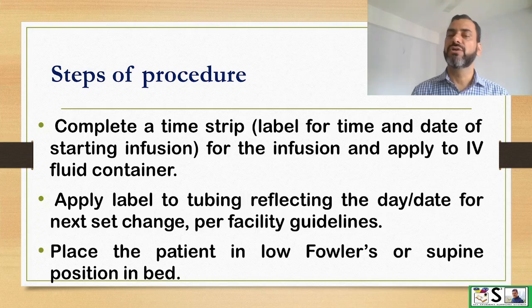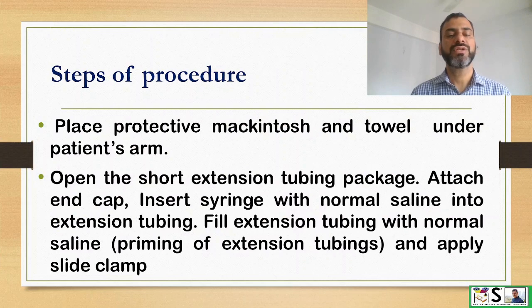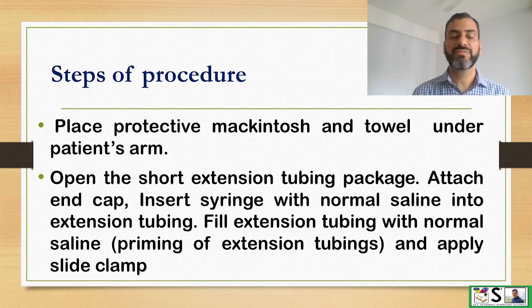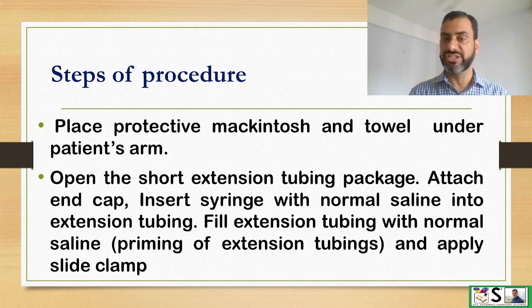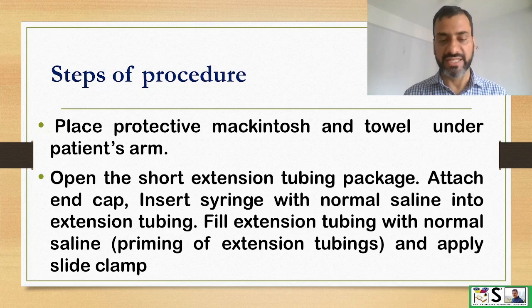Place the client in a low Fowler's or supine position in the bed. Place a protective MacIntosh and towel under the patient's arm. Open the short extension tubing package, attach the end caps, insert normal saline with a syringe, and prime it so that air is removed and the extension tubing is filled with normal saline.